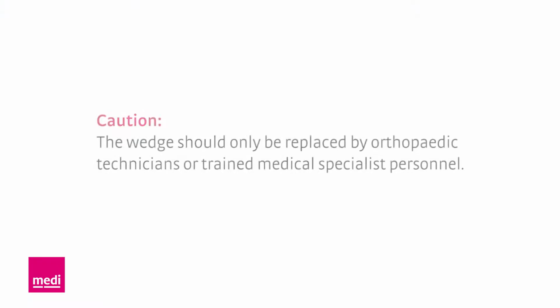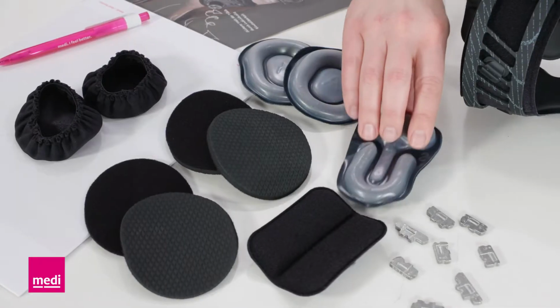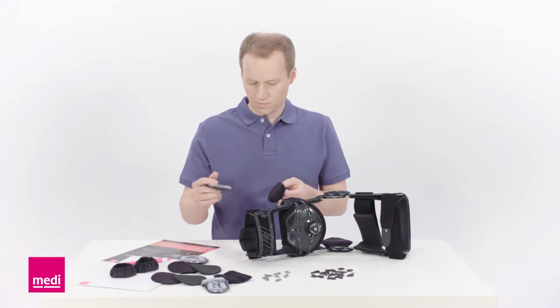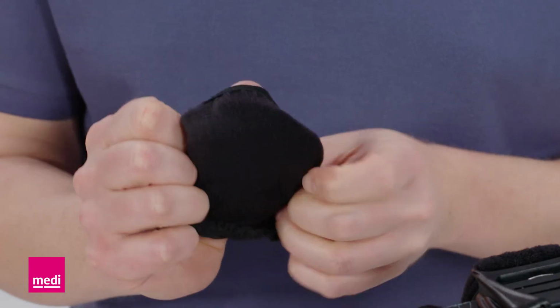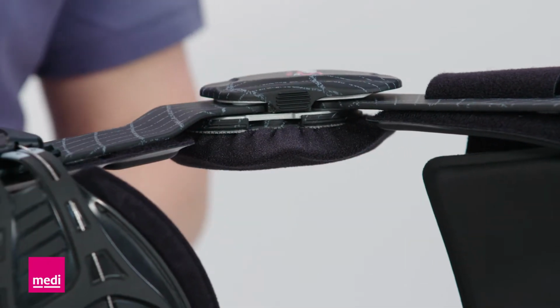Caution: the wedges should only be replaced by orthopedic technicians or trained medical specialist personnel. Replaceable pads can be used on the interior sides. This will ensure an optimal positioning of the orthosis even in cases of very small knee circumferences or varying levels of swelling.